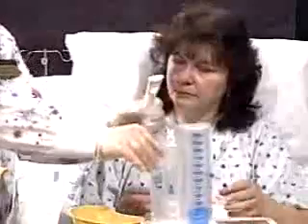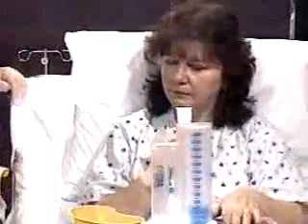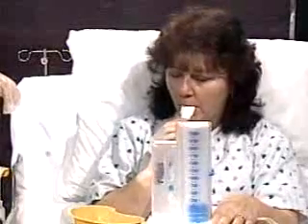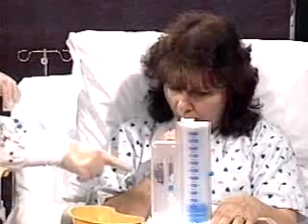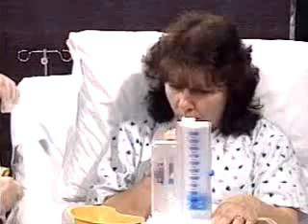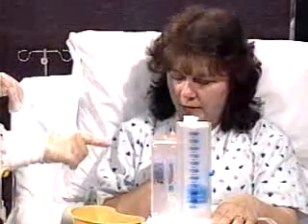If you have questions about that, check with the nurse. Have the patient hold the spirometer's mouthpiece with one hand and the spirometer with the other. Have the patient exhale normally and then place lips securely around the mouthpiece. Have the patient take in a slow, deep breath until the piston is elevated to the predetermined level.